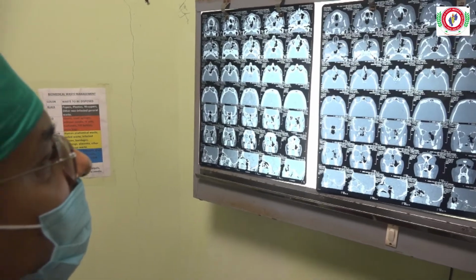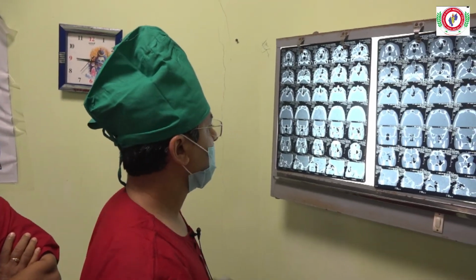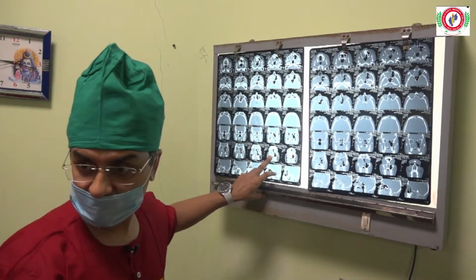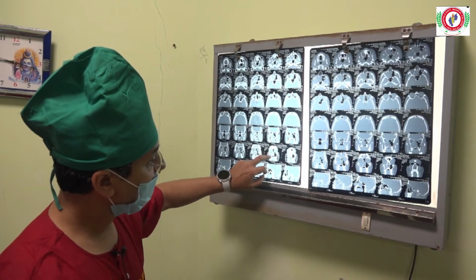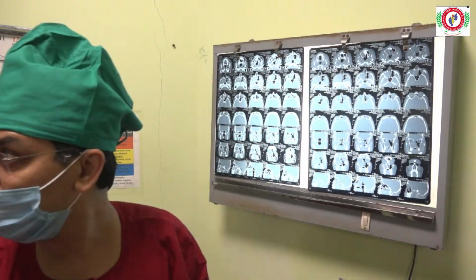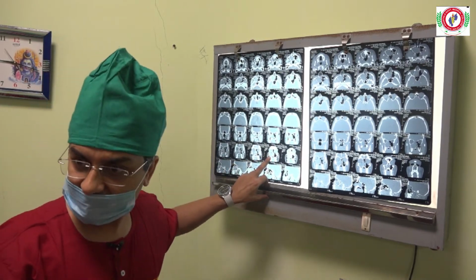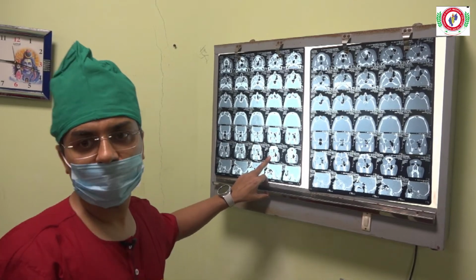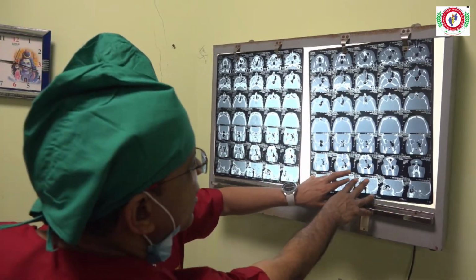Okay, so these are the coronal cuts. Any questions or anything related to the CT? You have given a very detailed explanation of all the findings there. Thank you so much. Sir, how would you explain this heterogeneity? This can happen in hemangiopericytomas also. This heterogeneity can happen in inverted papillomas also.